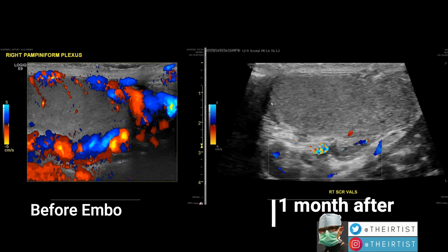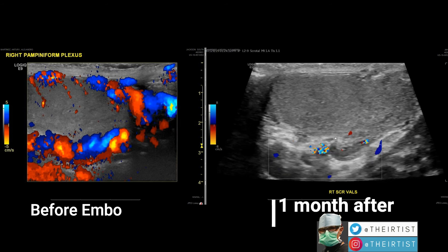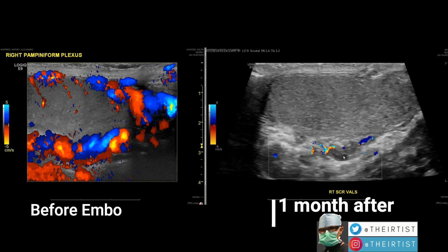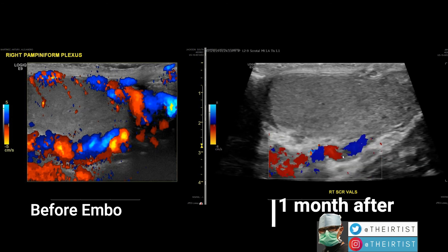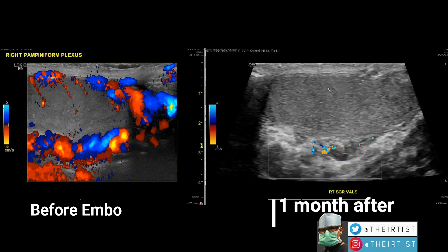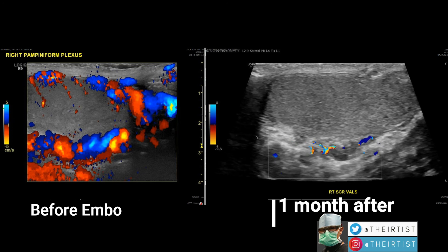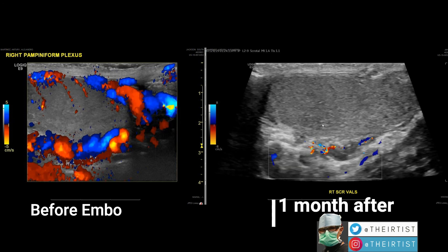After the embolization, on the right-hand side you can see the ultrasound done one month after the procedure. Immediately you can notice the difference — there is less blood reflux. There are still some dilated veins, which is normal; they will shrink and disappear over time. The testicle has more space. There is still a little signal representing blood flow, but we don't see nearly as much reflux as before. This is quite evident on these images.